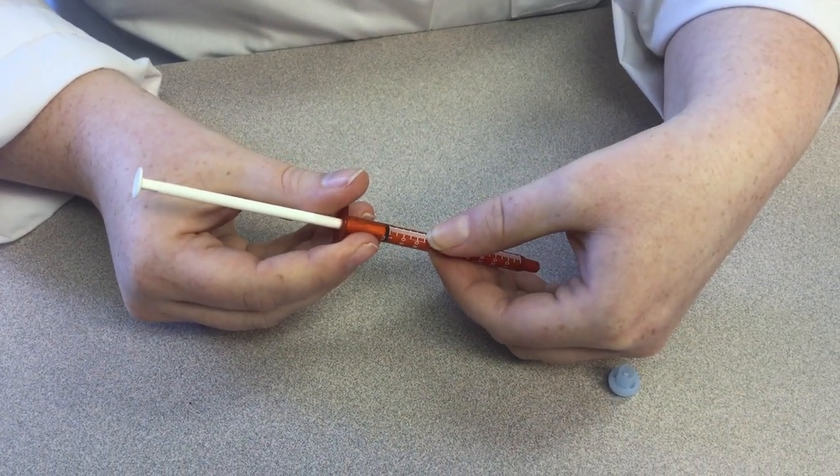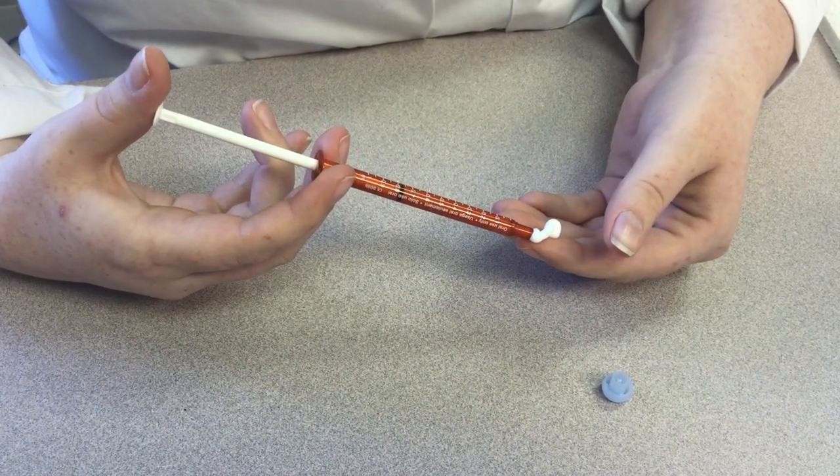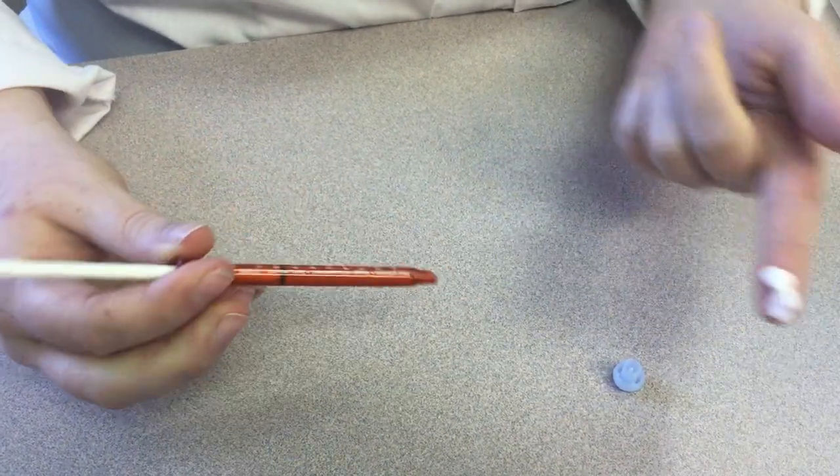You will then dispense down to the 0.75 mark on the syringe, which is halfway between the 0.7 and 0.8. That amount will look like this.